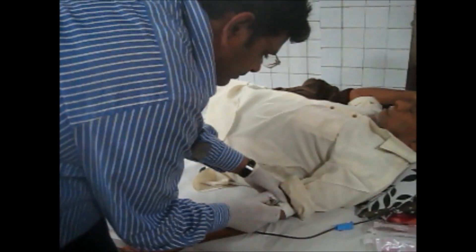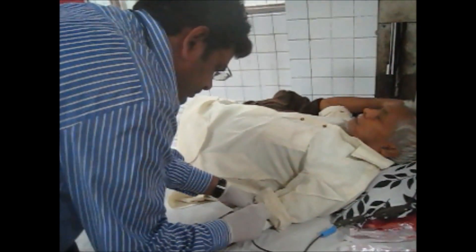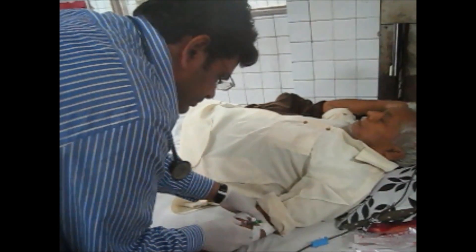Now give instructions to the patient: if you get any allergic reaction, if you have any itching, if you have any breathing problem, or any kind of problem, you must contact your doctor immediately. Before that, you have to stop the blood transfusion, as it may be a transfusion reaction. The doctor will then come and assess.